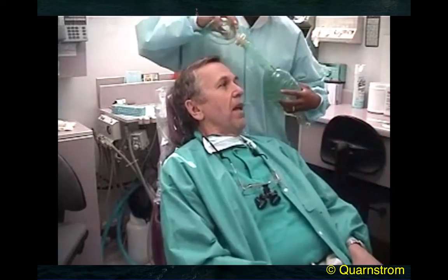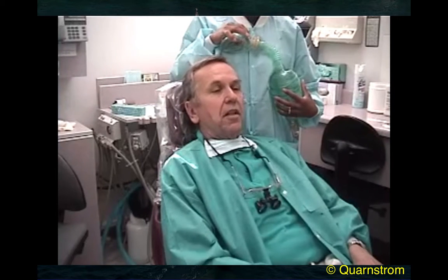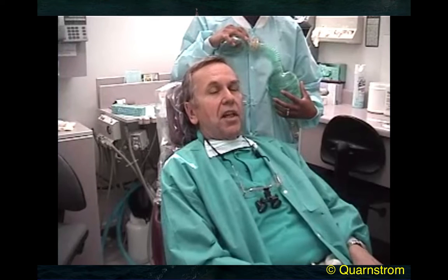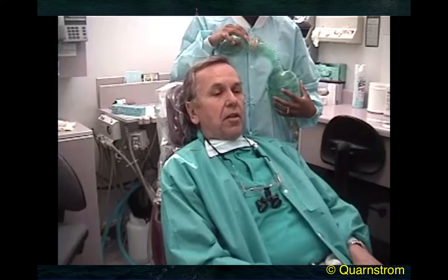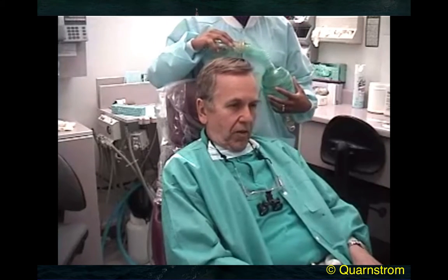Okay. Now, I think it's important that yearly you have your staff breathe for you, and you don't want to be too easy a patient, because if you actually ever needed to do this for somebody, a couple of things may be noticed. First of all, if their chin is down like this, you may very well hear the following.